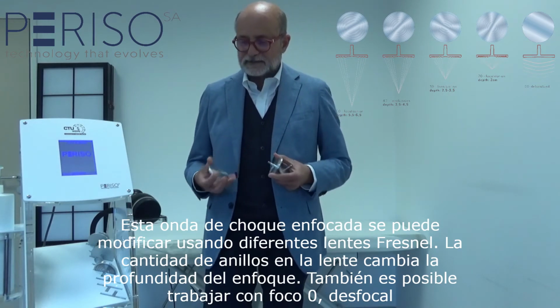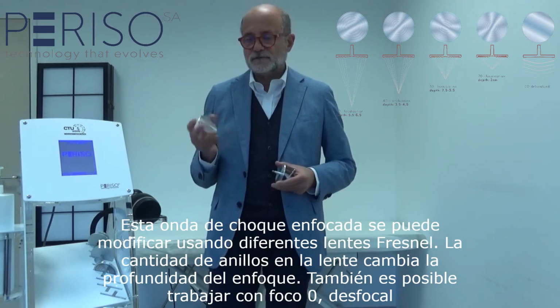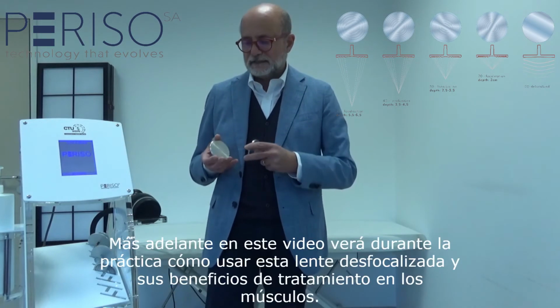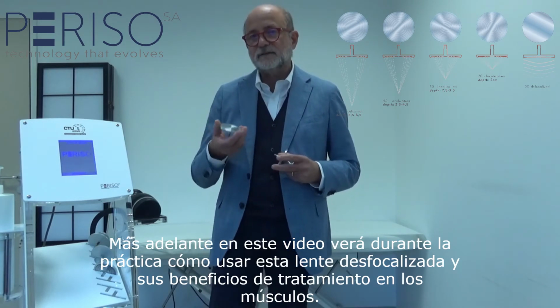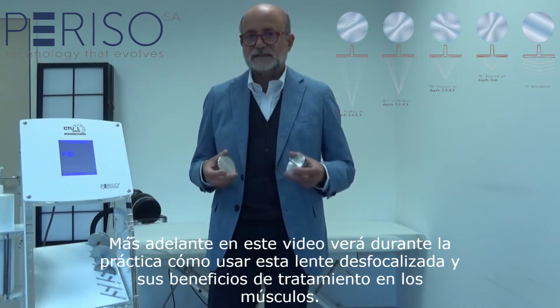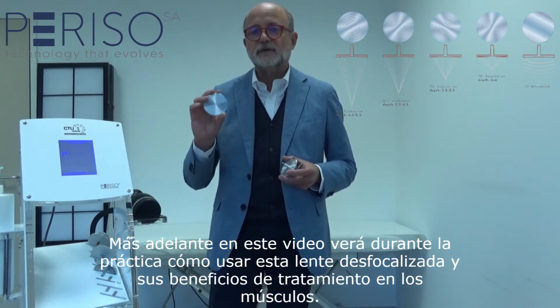Very interesting is also the possibility to work at zero focus, and so we have a volume of mechanical energy that as a cylinder flows inside the body, and we can use, and you will see in the practical aspect of this presentation, the possibility to work in a good way on muscles.